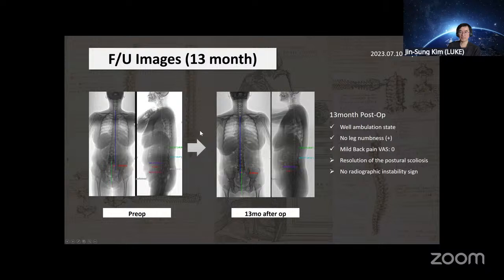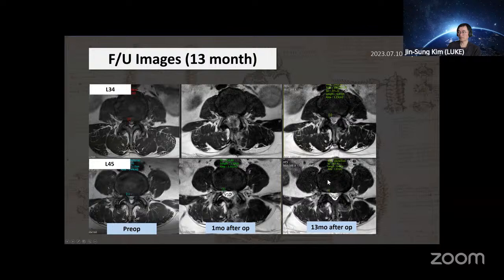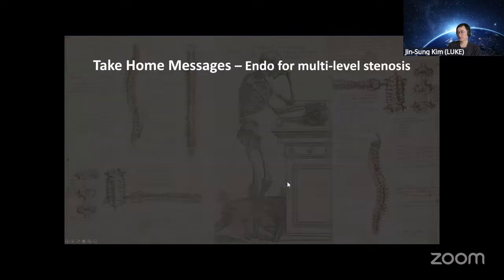I followed this patient for more than 1 year. You can see the outcome, super, at the post-immediate and 1 year follow-up. So it totally remodeled the spinal canal, with minimal damage of the muscle as well.